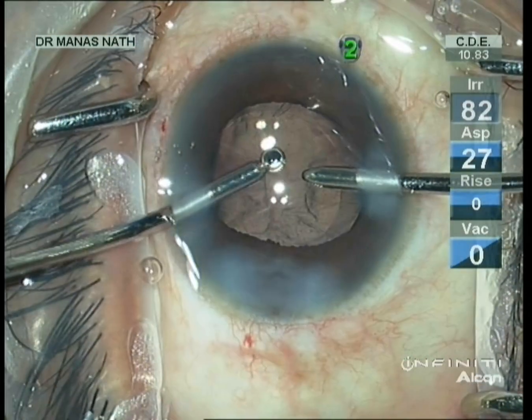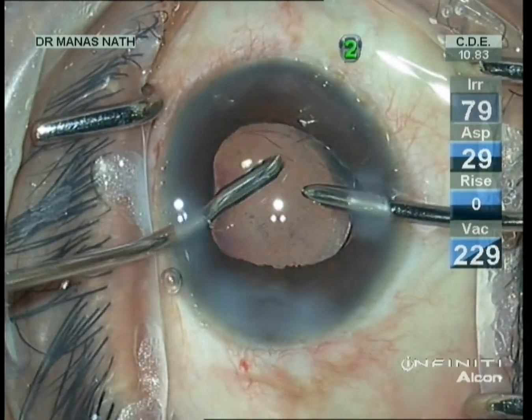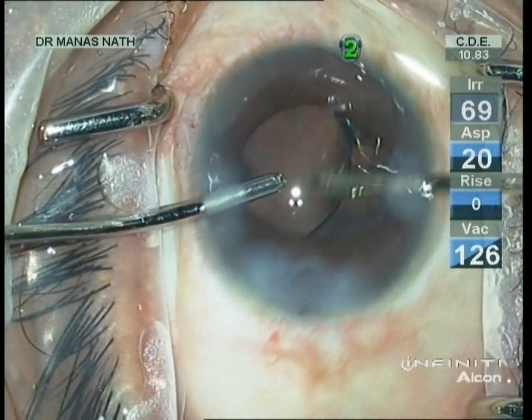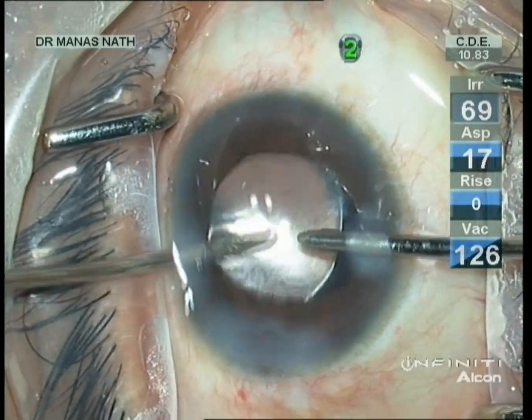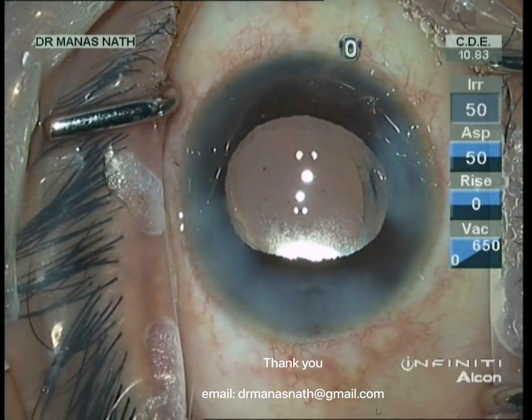Now I am going to remove the viscoelastics — going below the IOL optic to wash out the viscoelastics. Thorough visco removal is very important in all cases.